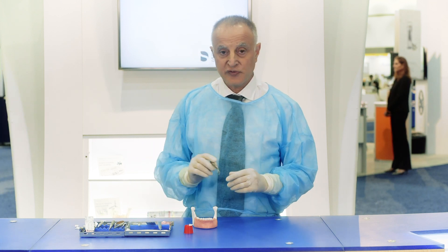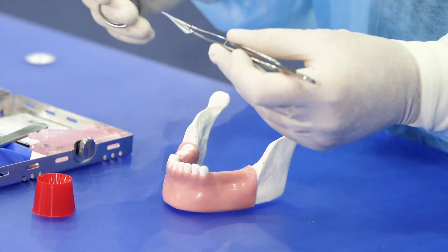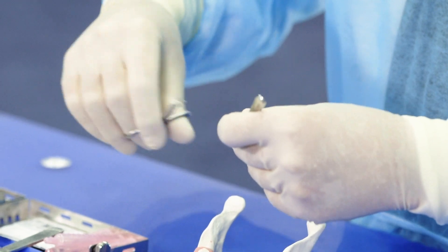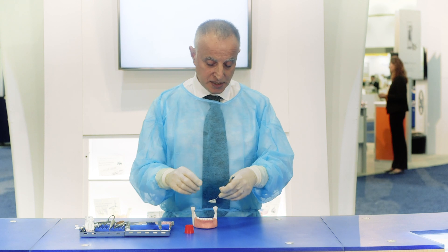Once it's fully hydrated, we can trim the membrane to its final size and shape. The lingual aspect should be rounded as you see here — the round part of the membrane goes into the lingual side.